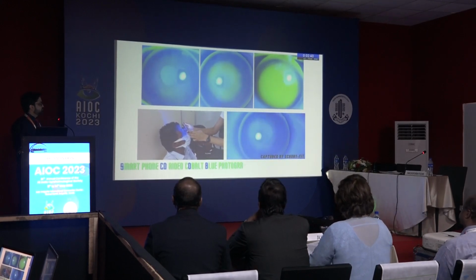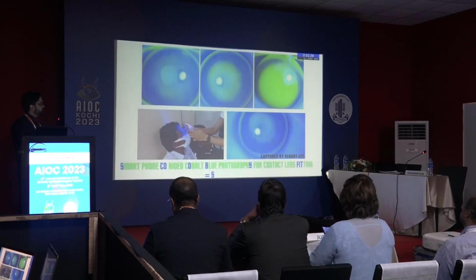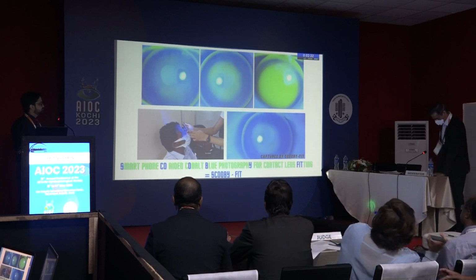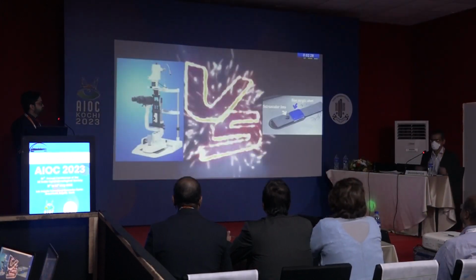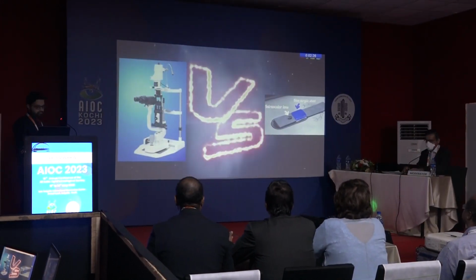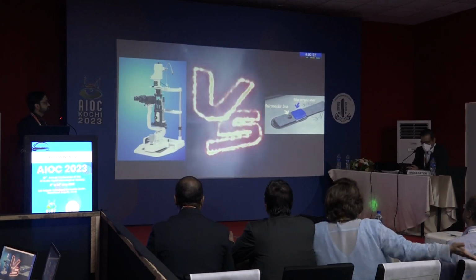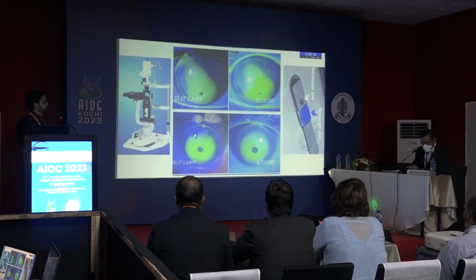Optimum contact lens fitting is crucial for long-term safety and compliance, and fitting by assessing fluorescent pattern has been in use since rigid contact lens came into market. We pit our device against the OG slit lamp microscope. We assessed contact lens fit using fluorescent staining patterns of 128 eyes using our do-it-yourself device and compared it to slit lamp imaging.